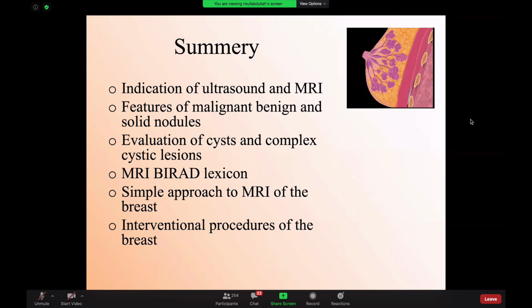Okay. The next from Dr. Sarah. Could we differentiate between mastitis with abscess versus galactocele? Yes, galactocele, usually the patient is lactating. Usually you see a well-defined wall and you might see no surrounding inflammatory reaction. So the fat will not be inflamed. There is no skin thickening. You might see a fluid level.